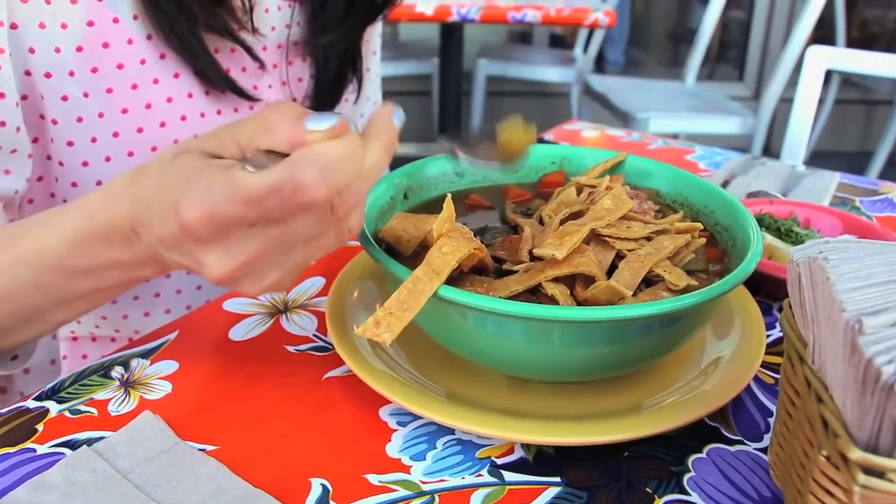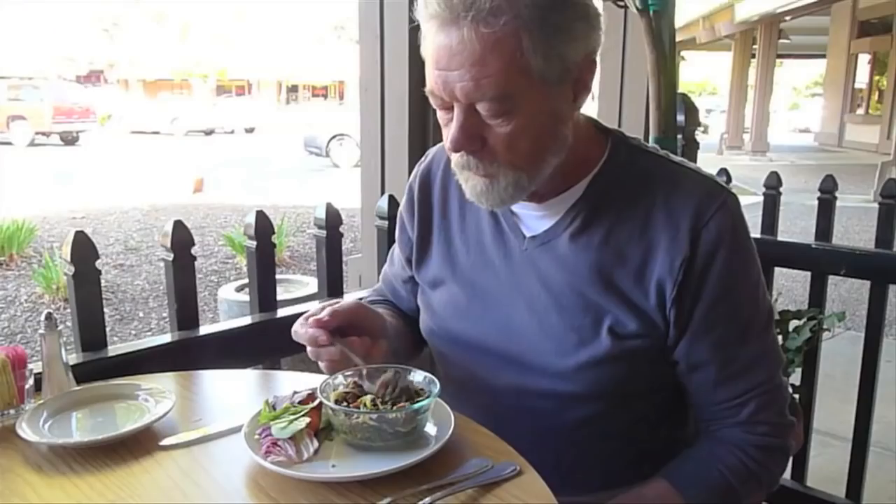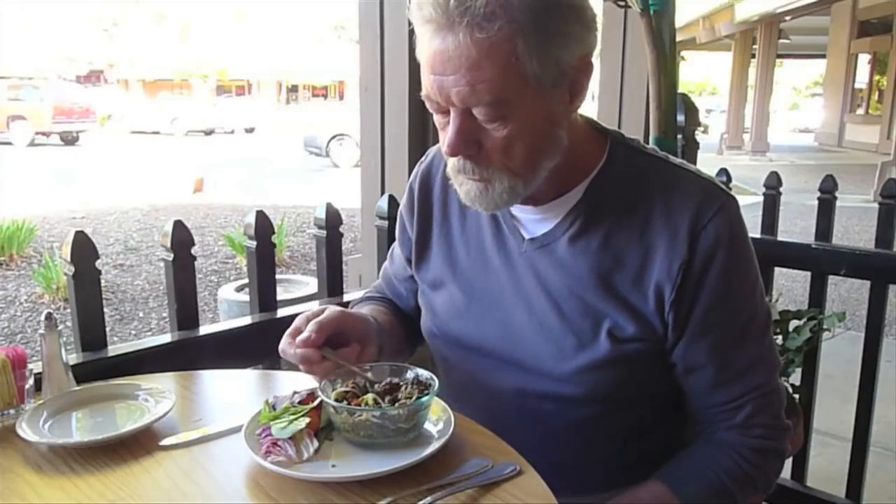Currently, there's no cure for these disorders, and the solutions out there often fall short or are invasive. After seeing some of my own friends struggling with their tremor, I realized the frustration, loss of dignity, and social isolation that tremor can have. I wanted to create something that would allow people to go out to restaurants or simply enjoy a meal without stress.